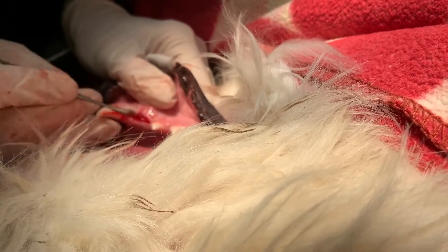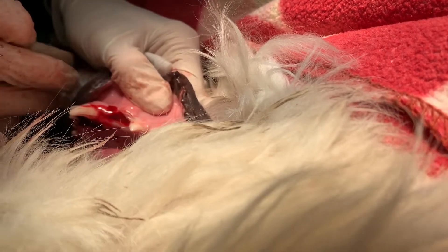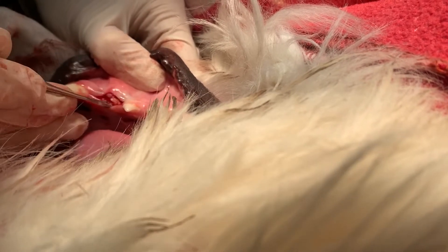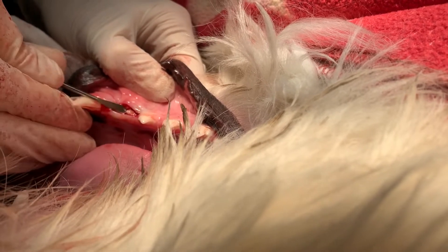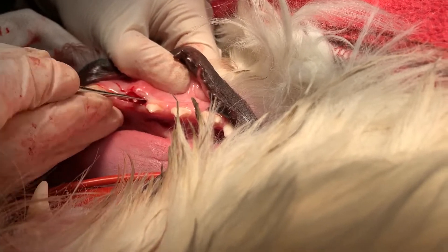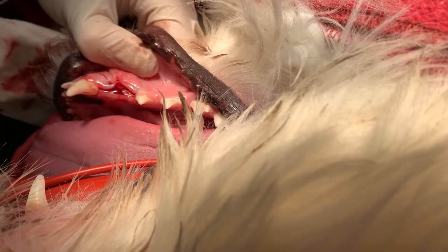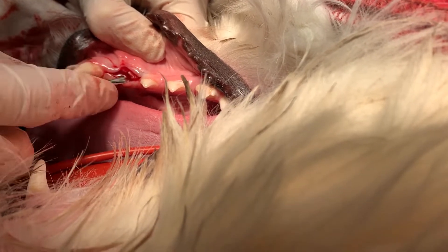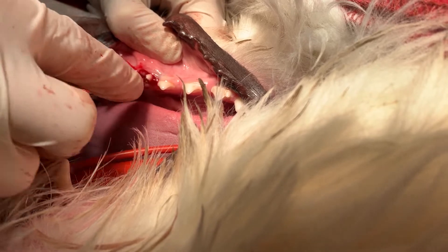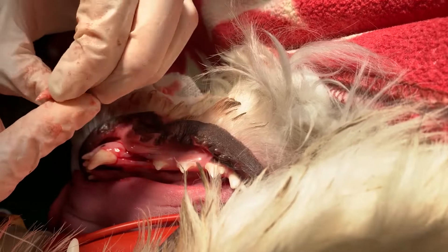This guy goes home same day. He will have instructions limiting what he is able to eat and play with. Spoiler alert — he did go back to playing with his toys pretty quickly, and I did have to tell his dad we don't want to do that. You can see there's the tooth that was sitting right underneath the gingiva and just didn't erupt. We do have restrictions after these guys go home because of the stitches — we don't want them eating hard food or playing with toys that are going to cause those stitches to rip open. Thankfully, that tooth elevated out pretty easily.